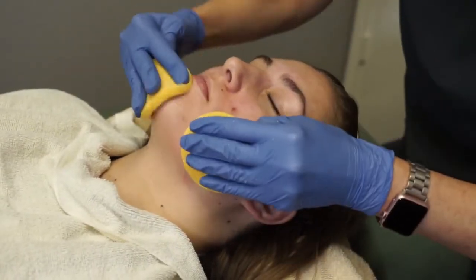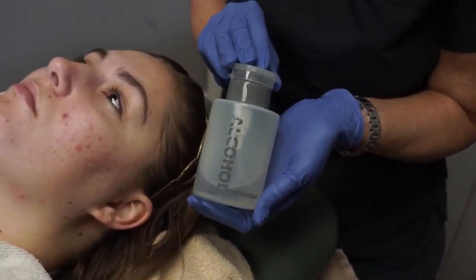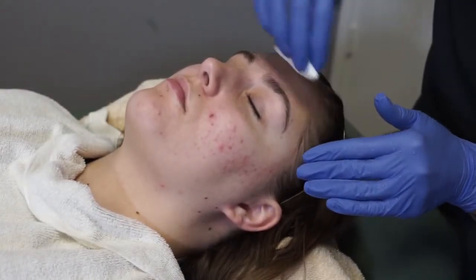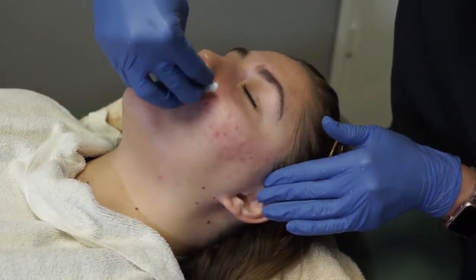Once the face is thoroughly cleansed, apply a cloth or towel to protect the patient's clothing. Finish the skin preparation process by gently sweeping the area with an antiseptic solution-soaked swab, ensuring the entire intended treatment area is clean and swabbed. Once the face is completely free of debris, you may consider taking a before photo if you haven't done so already.